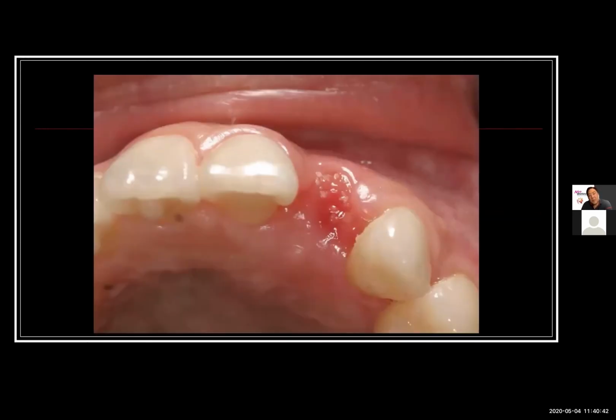So this is an occlusal view. And if you look at this occlusal view, we can actually appreciate, it doesn't look too bad if we compare it to the contralateral side. It actually looks pretty symmetrical to the opposing side, right? So even though we over-engineered and overbuilt this hard tissue and soft tissue, we still got some rebound, we got some relapse. But looking at this case now, we have some decent soft tissue where we have the second opportunity to treat the soft tissue aesthetic concerns for this case, which is why in this type of case, it was imperative that we treat this as a delayed approach, meaning we stage the case, we extract it, we graft, right? Take care of the hard tissue support first, come back, and then we can deal with the soft tissue concerns for this case.